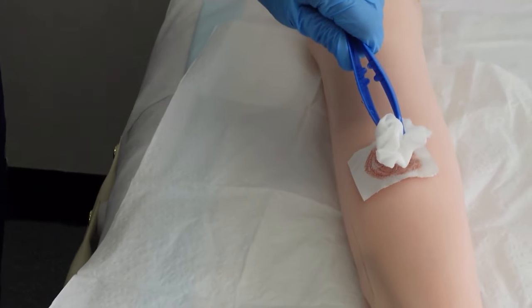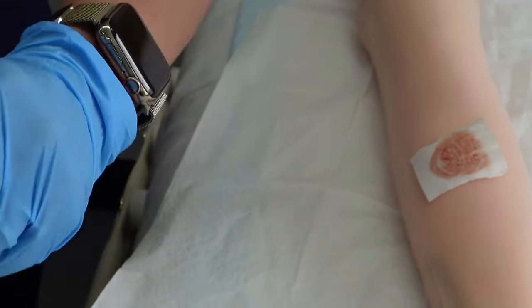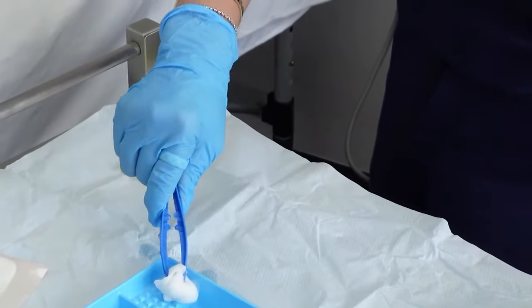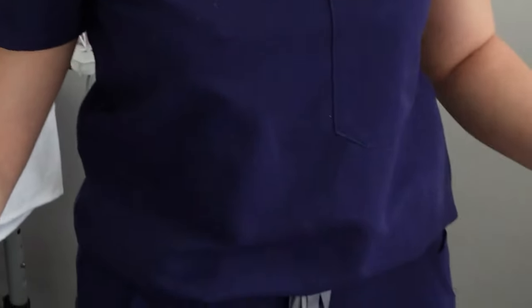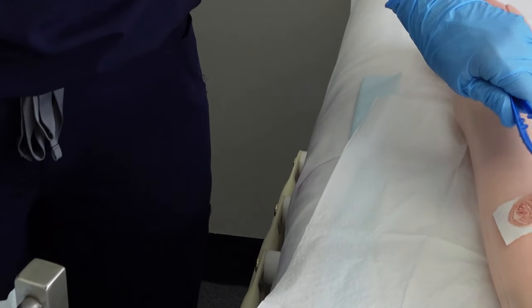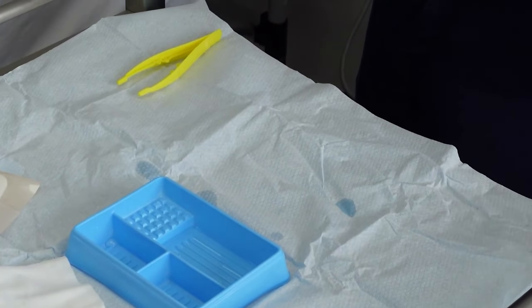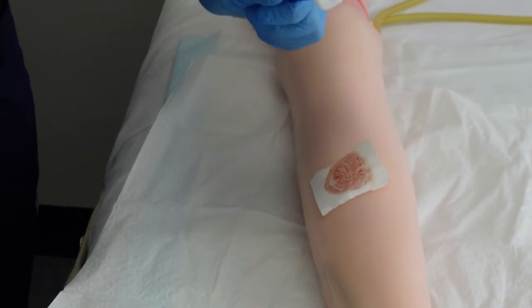To clean a circular wound, you start at the middle and work outward, then throw the gauze away. If it's a surgical straight-cut wound, make sure to wipe the wound from top to bottom. Make sure the dirty tong doesn't come back onto the sterile field. While cleaning the wound, ask the patient if there's any pain during the dressing, so you can prepare in advance if the patient needs something for pain.